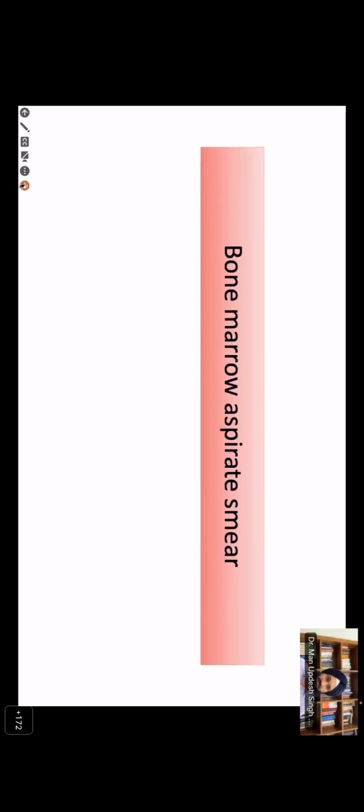Okay, I don't have the picture. Bone marrow aspirate. So who comes in? Like Tanushri Purohit come in for aspirate. So at low power, any comments in this 61-year-old? Sir, probably a normal cellular marrow can be seen, and the trail looks moderately cellular. Okay, so yeah, I'll accept that.